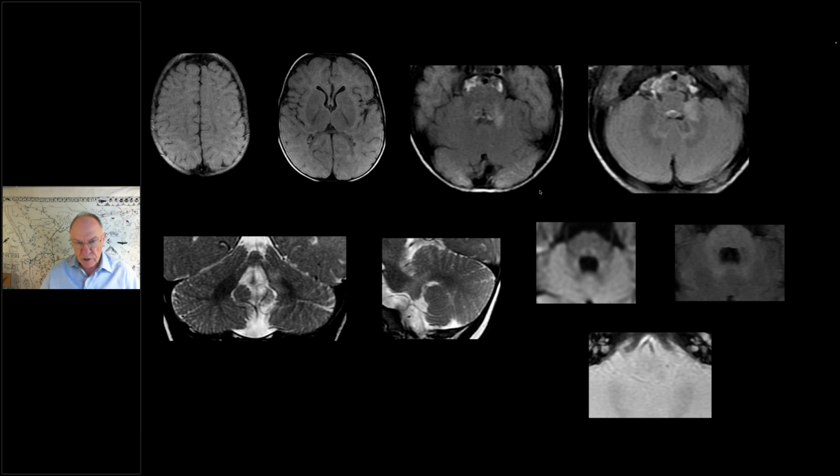I have no contribution. It was an incidental finding. It was seen on CT as well as hypointensity. To further characterize, we had got this MRI done. It looks very likely hematoma is what we thought after discussion. Child is not symptomatic for this lesion clinically. Okay.